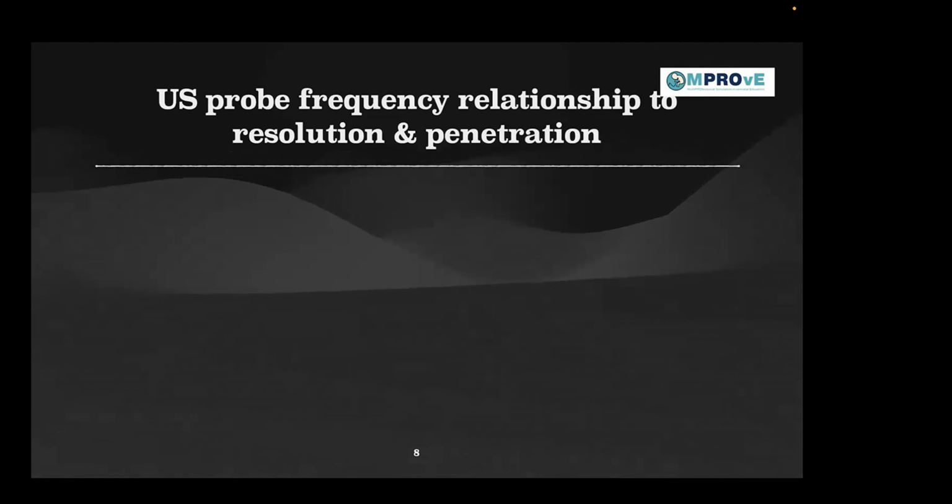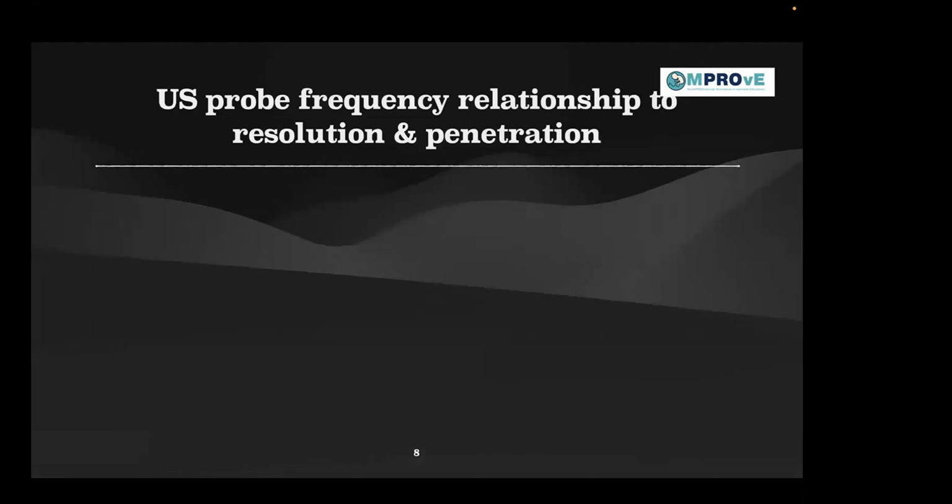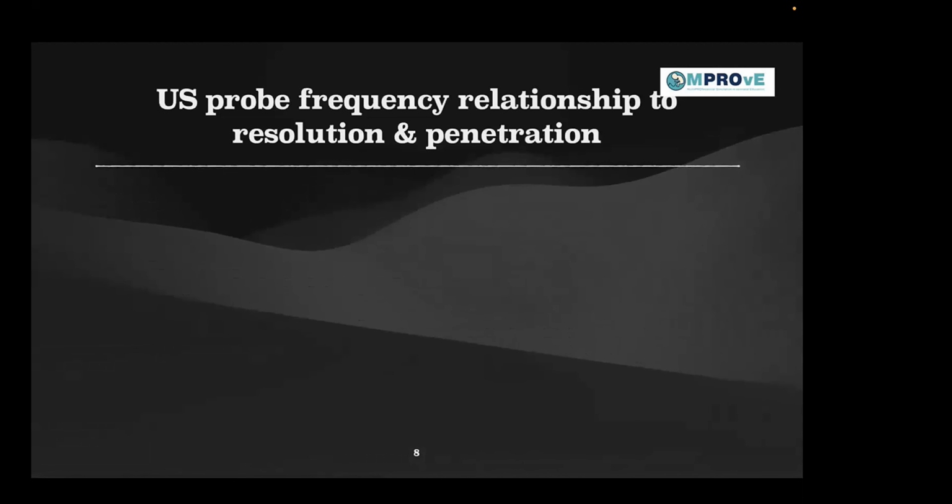If you want to look at anything such as the lung, which is the pleural line, very superficial, we always talk about a depth of 3 to 4 centimeters. So you can imagine it's a very superficial structure. Or, for vascular ultrasounds, again, very superficial structures. There you need a higher frequency probe, which will give you a very crisp image of the superficial structures.